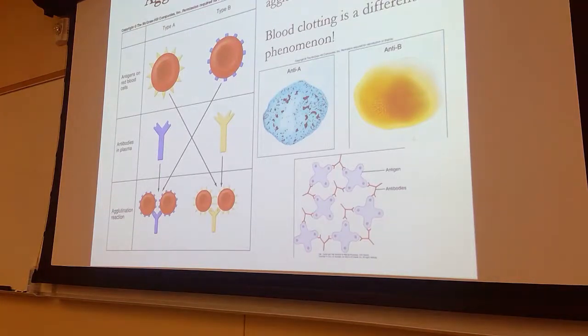So to these 3 drops of blood, to the first drop, you're going to add anti-A. You're going to take a toothpick and you're going to mix. If I have the A antigen, that anti-A antibody is going to lock onto it, just like Nicole's beautiful brown hair, I locked onto it. Don't you love it when people play with your hair, by the way? No? Even if she was lying, she's like, just get away from me, it's weird.